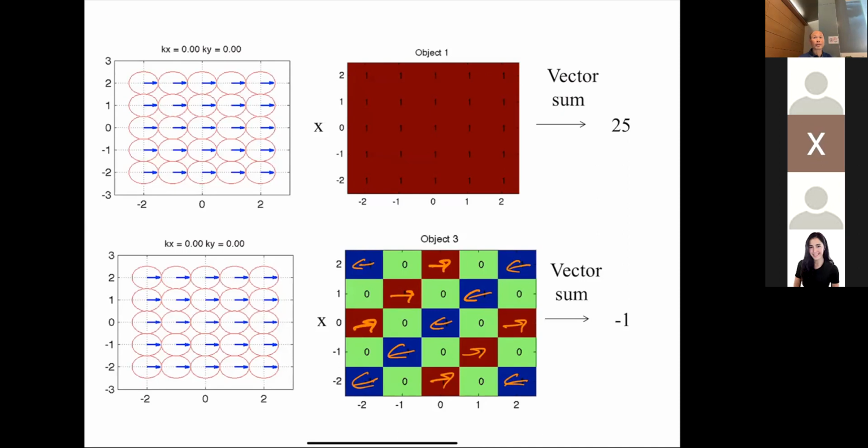Okay, yes, question. You said if you scan longer you get better resolution. Is there ever a plateau where increased time won't increase resolution? In principle, yeah, I mean, once you hit the atomic level, right? But really there are diminishing returns, because at some point your object may not have any energy out there. So it becomes, what resolution does your object actually have, and how much energy is out there. But yeah, in principle, the longer you scan, the more you get.